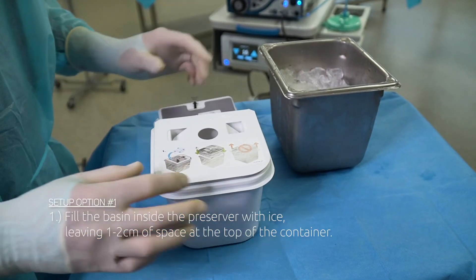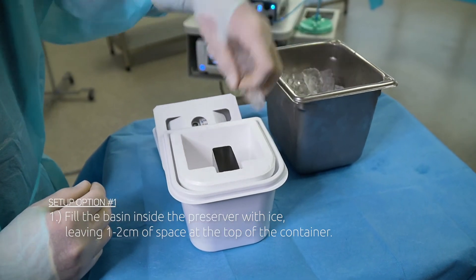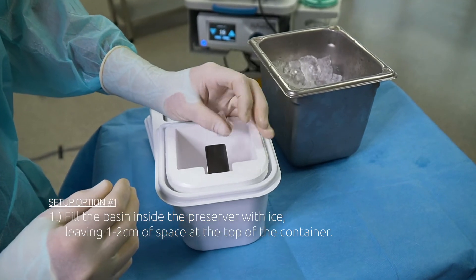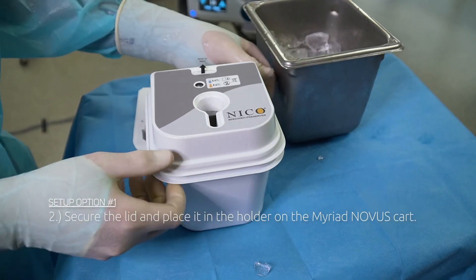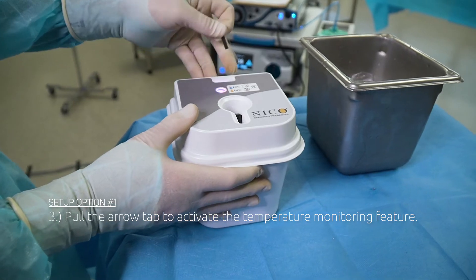Step 1: Fill the basin inside the preserver with ice, leaving 1-2 cm of space at the top of the container. Step 2: Secure the lid and place it in the holder on the Myriad Novus cart.